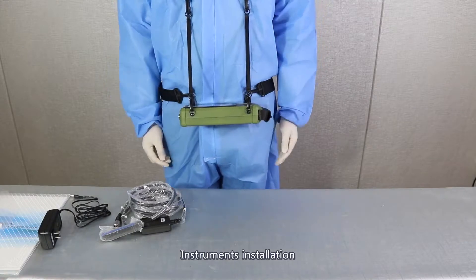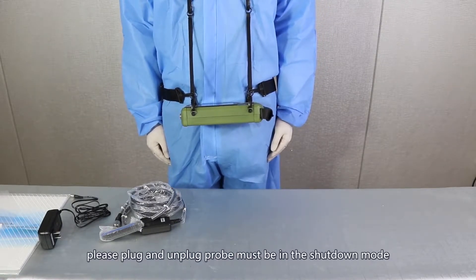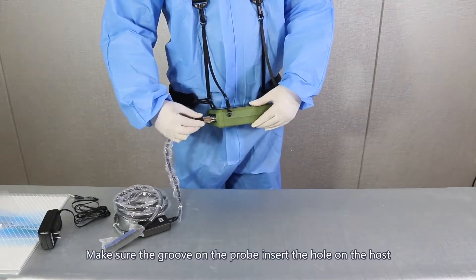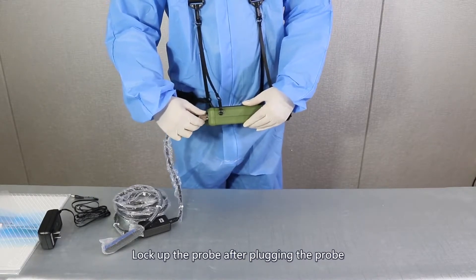Instrument installation. About the probe connection, please plug and unplug the probe only in shutdown mode. Make sure the groove on the probe inserts into the hole on the host. Lock up the probe after plugging it in.